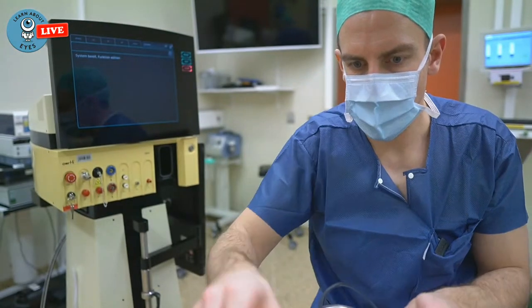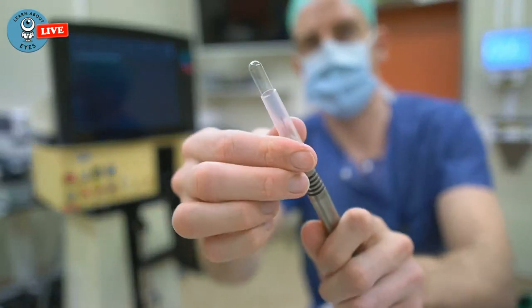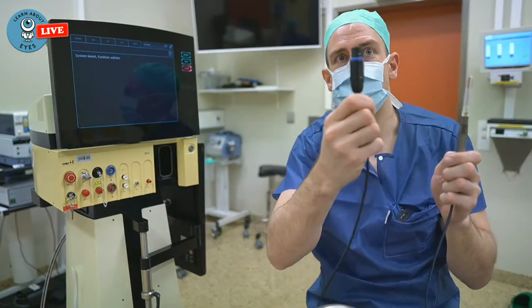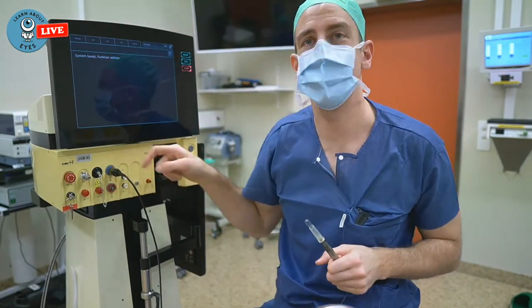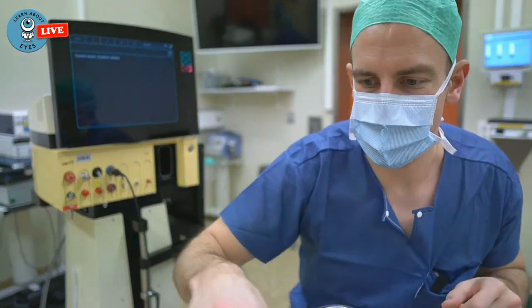Okay, so we did this. Let's put that. I don't know what the official name of that is, but it looks like a condom kind of. Then plug the phaco tip in. It's really easy. Blue goes to blue, so that even doctors can actually know how to do it.